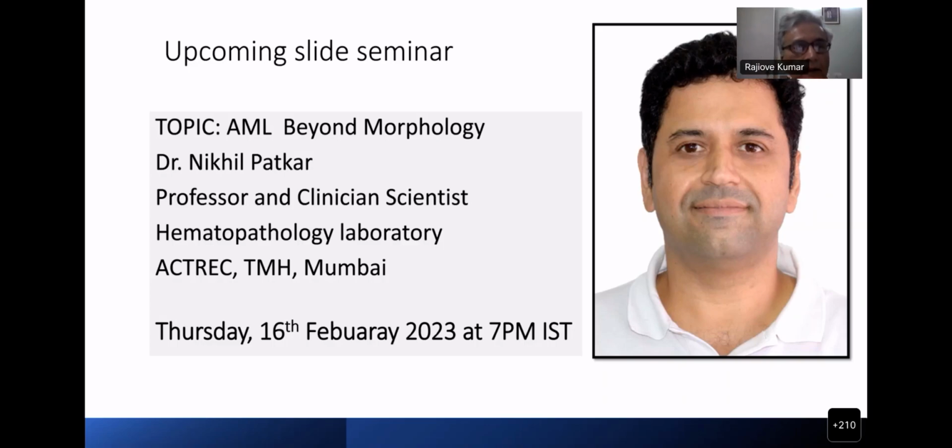The first case, the hypogranular case, who was describing that? Me. Yeah, you are the one who does not have access to flow and molecular, isn't it? Am I right? Yes, sir. That is the kind of case on which you should practice a lot. Look at the cells in the proper manner, become familiar, because that is one thing where you should give a diagnosis straight away. As Nikhil said, a morphological diagnosis must be given very, very fast. That was a very straightforward case. Case 3 also was straightforward, and you said you were able to diagnose by RNA-seq. Am I right? Yes.